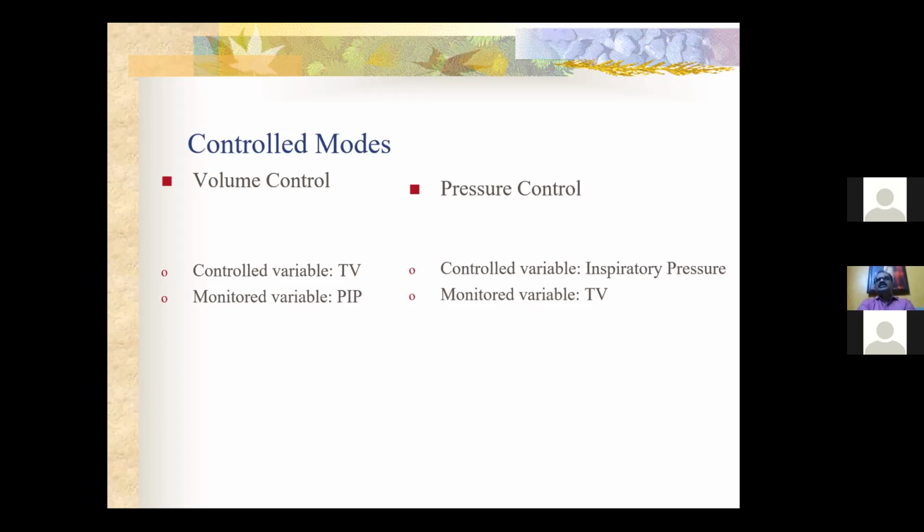But once the bronchospasm is relieved by your medications, then the compliance of the lung will be better. So that 18 pressure that you have been keeping might produce a higher tidal volume.